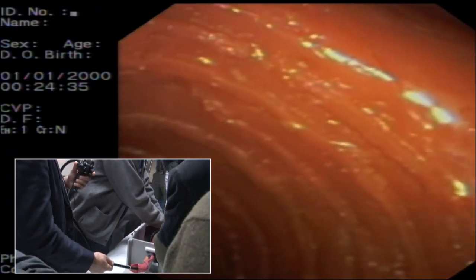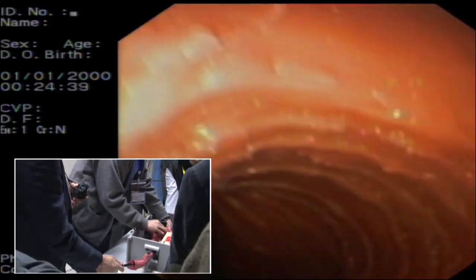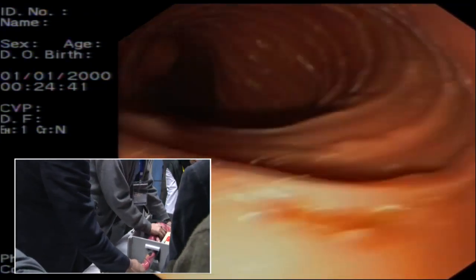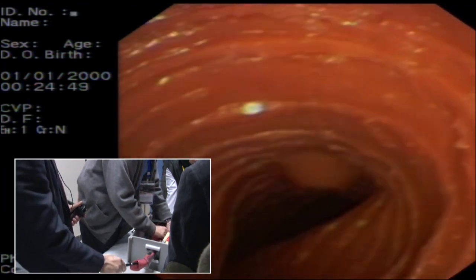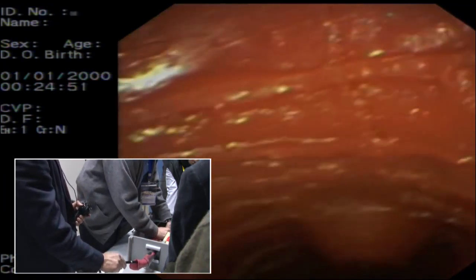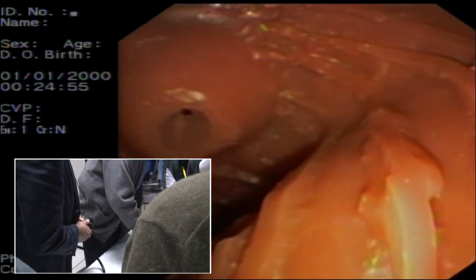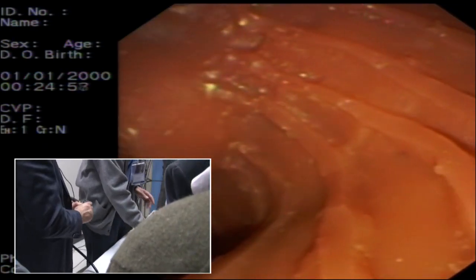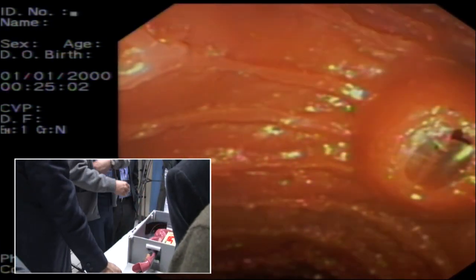One minute, let me put it in a better form. So last time we positioned it that way. Yeah, that's it, right. Right, yeah, that's better. Okay?